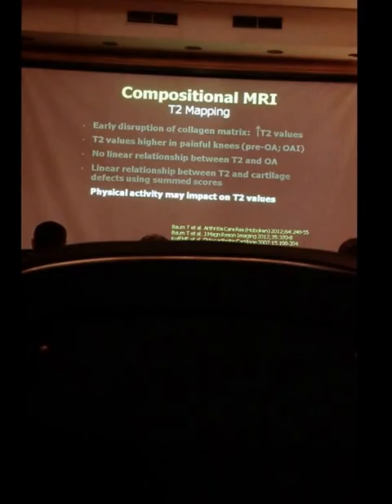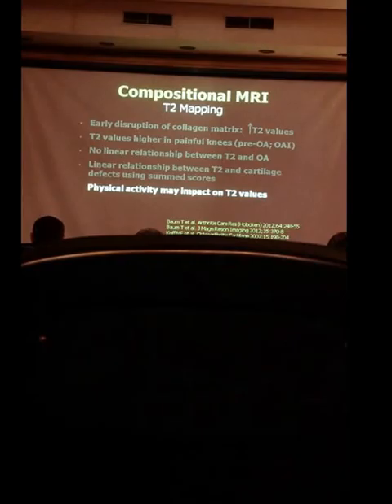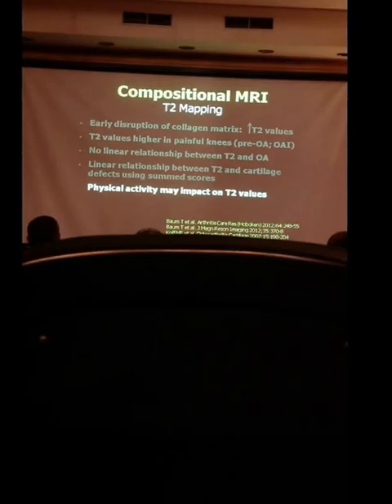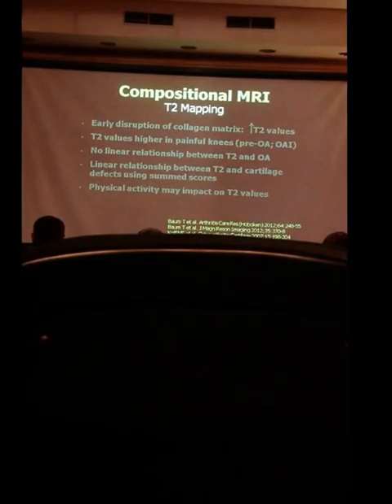So when a patient comes to the facility to do an MRI, and you want to do T2 maps, if you know that the patient climbed stairs for 10 floors, and you put him in the machine, there are going to be alterations all the way. So we cannot do that. We have to prepare the patient. We have to put the patient at rest before applying such techniques.